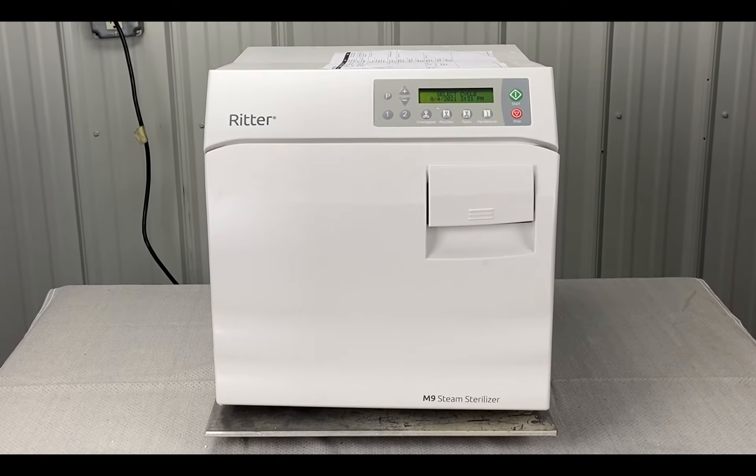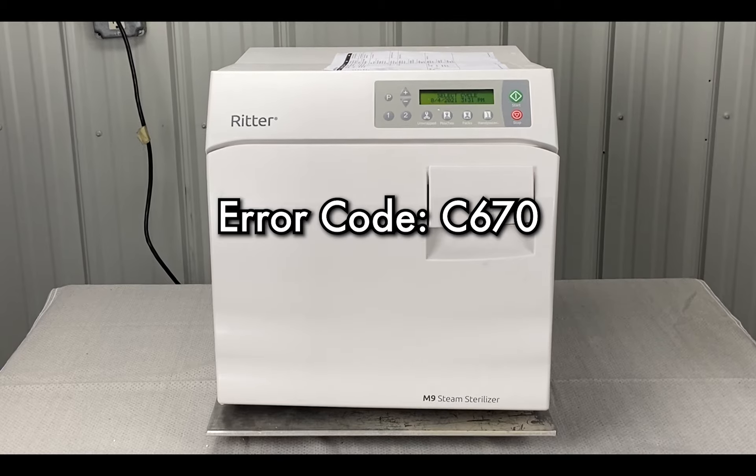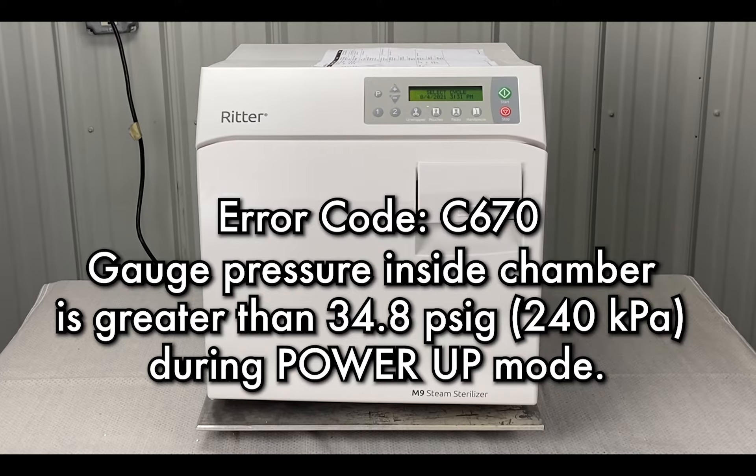We're going to talk about error code 670, power-up mode, pressure over limit. It says the gauge pressure inside the chamber is greater than 34.8 PSIG during power-up mode.